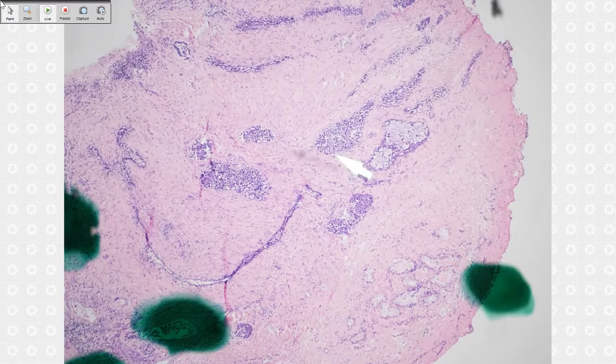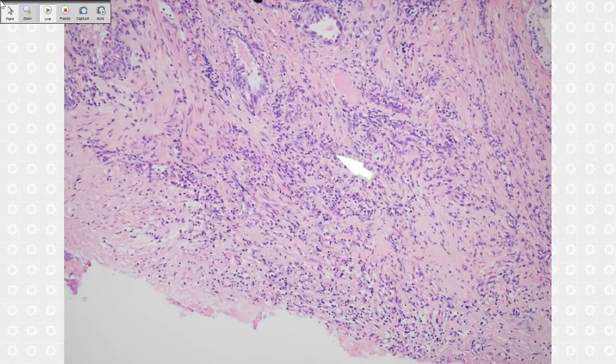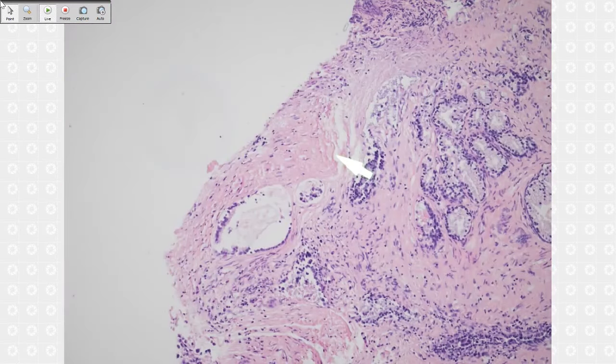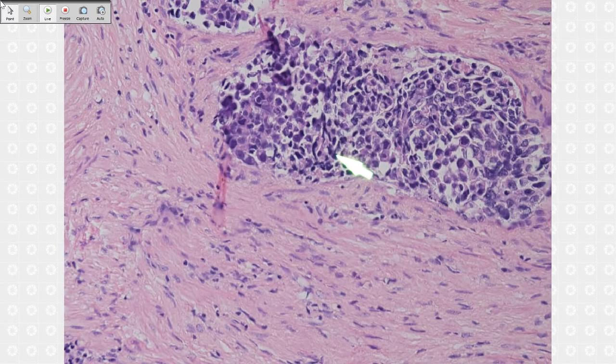So this one is interesting. This patient is 90 years old, prostate urethral biopsy. Then we get this specimen we see here. So this one is definitely prostatic tissue here, right? Prostatic tissue, maybe with chronic inflammation here. There's a little bit of gland. But here, what we saw is something growing here, ugly looking cells here, right? Did you see this? Ugly looking.